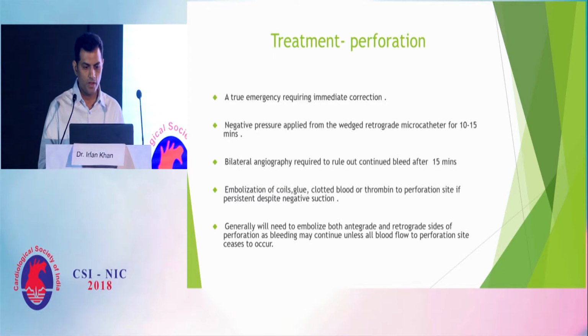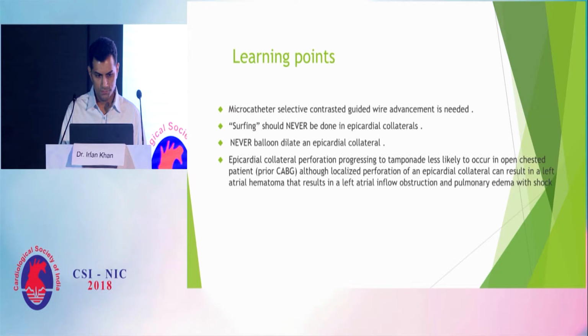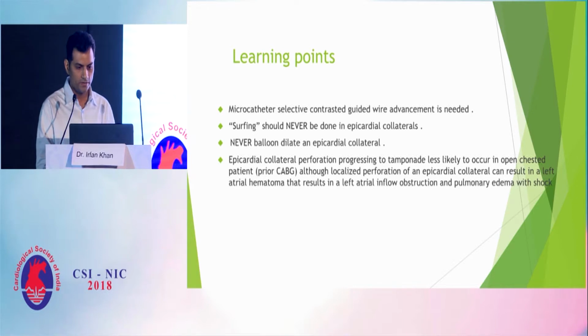Treatment of such a perforation is a true emergency requiring immediate correction. Negative pressure applied from the wedge microcatheter for 10 to 15 minutes, bilateral angiography, embolization with coils, glue, clotted blood or thrombin. Sorry, just a minute. So the learning points are that microcatheter selective contrasted guidewire advancement is needed. Surfing should never be done in epicardial collaterals.